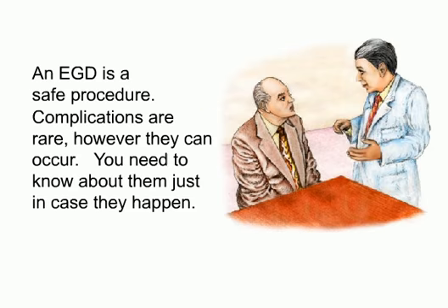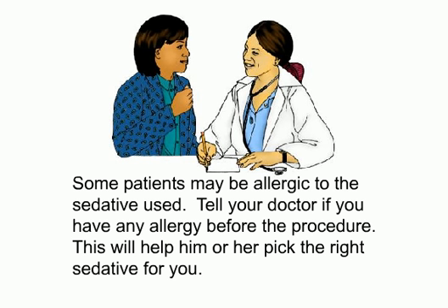Risks. An EGD is a safe procedure. Complications are rare, however they can occur. You need to know about them just in case they happen. Some patients may be allergic to the sedative used. Tell your doctor if you have any allergy before the procedure. This will help him or her pick the right sedative for you.